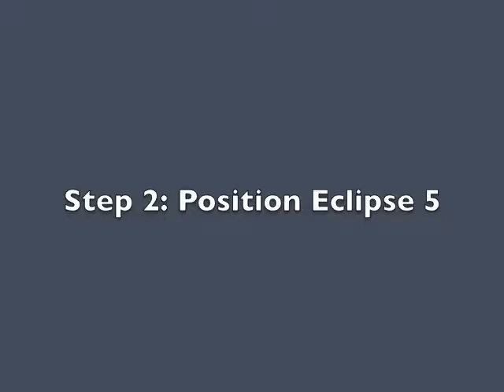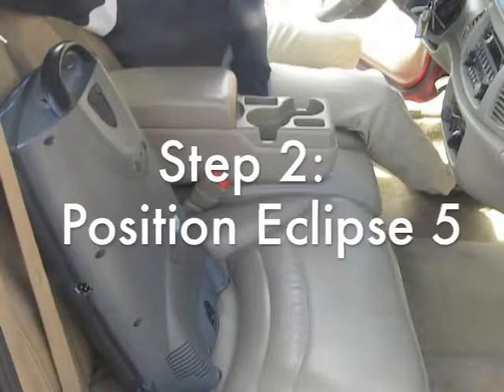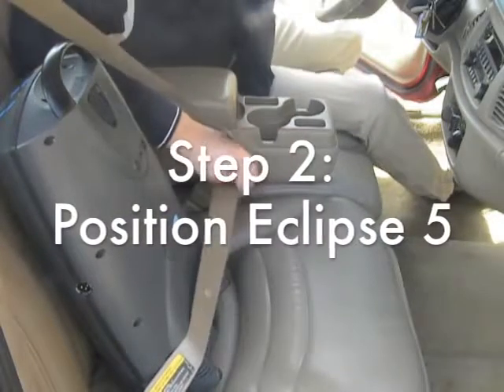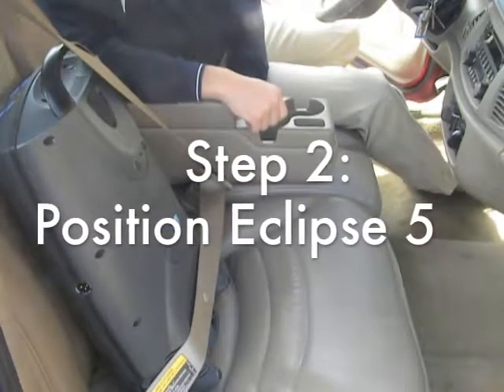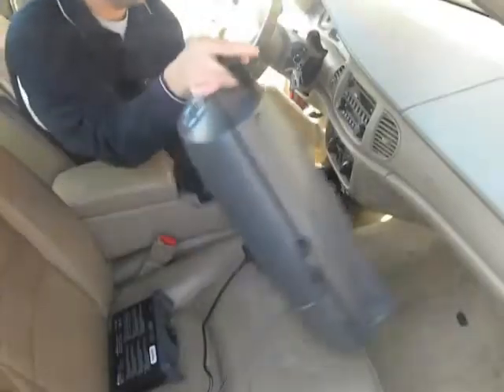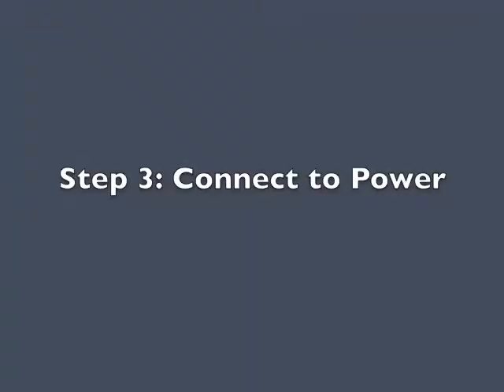You have several options to properly position it. You can use the front seat, you can put it in the floorboard, or you could also put it in the back seat. The important things to note as you're properly positioning is that it doesn't rattle around or fall, and that the air intake filter on the back and the exhaust port on the back are not obstructed or blocked. Now you're ready to connect to your DC accessory outlet in your car.